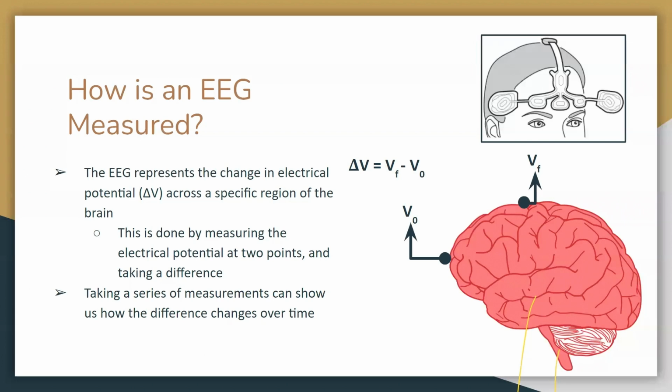I know that's not a satisfying answer. I think it does make sense. I was told by one of the instructors that if you're doing propofol, you have your picture with the red on the delta and a little bit less red around the alpha, the 8 to 12. And you play with the scale until you get the pattern you would expect for the drug. I don't know if that's the right answer. It's pretty empirical, right? They told me the same thing, and I feel like you can manipulate it so that you can make it look exactly like that. That's my view, that you can be misled.